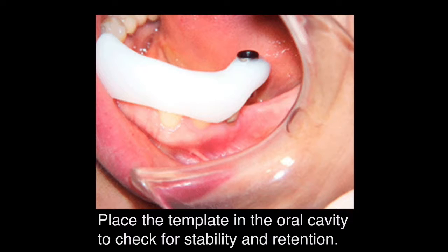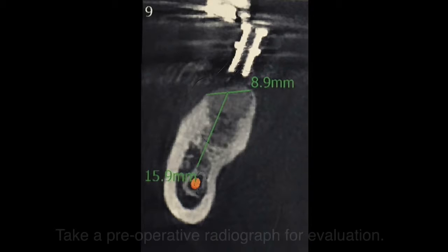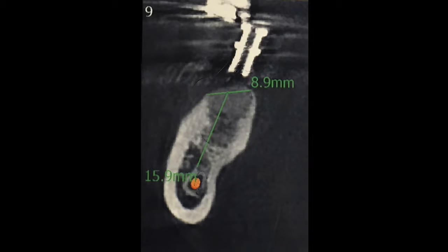Place the template in the oral cavity to check for stability and retention. Take a preoperative radiograph evaluation. The integrated 10 mm titanium drill sleeve of the free end set can be used as a radiograph marker on a regular x-ray or CT scan to verify the drilling positions and angulations are appropriate.